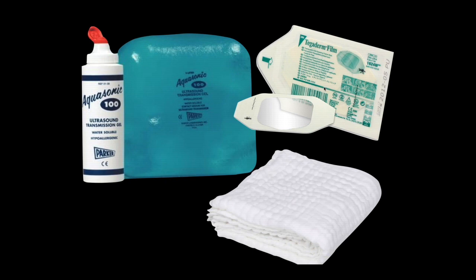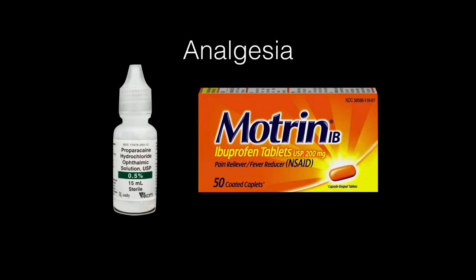But we know that gel on the eye is quite safe. It might cause a little burning and irritation. Having had these done on myself for practice, I can tell you it irritates the eye a little bit, but it's relatively mild. And before you do any type of exam, I'd recommend using some analgesia, primarily a topical ophthalmic solution such as proparacaine to help make the exam a little bit more tolerable.